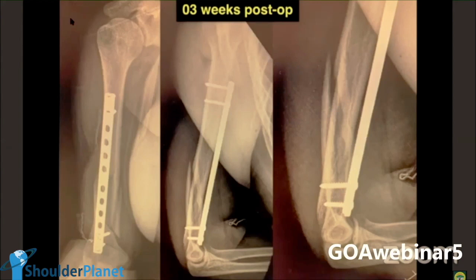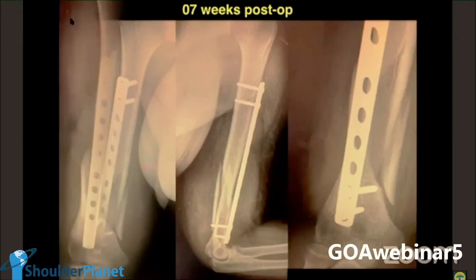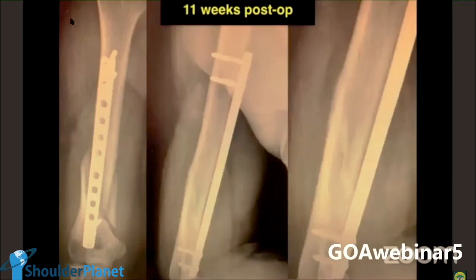What about 7 weeks? You have no callus, but the clinical picture is very nice. I'm going to show it in the next case because people must understand clinical healing precedes radiographical healing. You must never forget the clinical healing comes much faster than radiographical healing. So see this 11 weeks. A beautiful callus is forming posteriorly, but you have nothing in the AP. See the image on the left side between the segmental fracture medially and the metaphysis, you have nothing. The patient is doing fine.